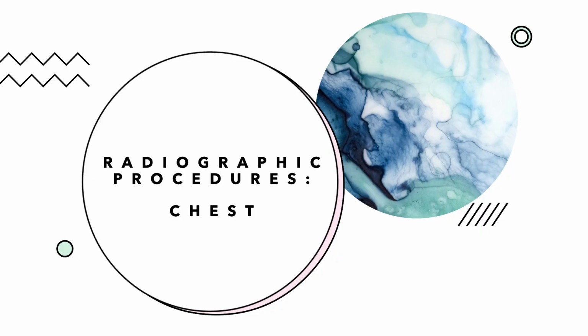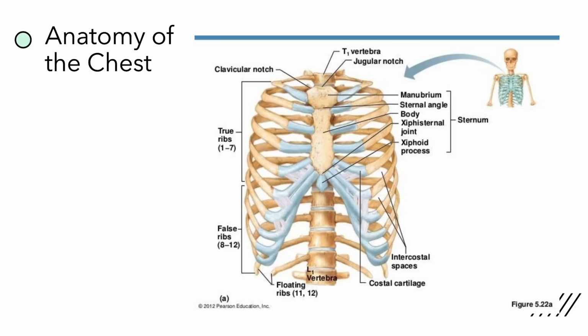of the chest. First, we have to talk a little bit about normal anatomy of the chest, what it would look like on x-rays, and what things we're actually trying to achieve in our image. So a little anatomy lesson that may be a review for some of you.